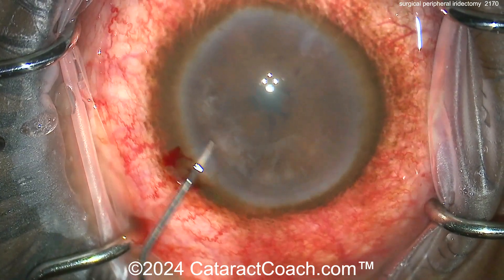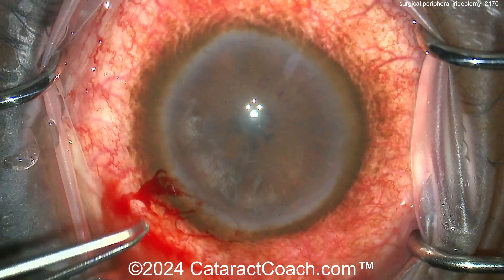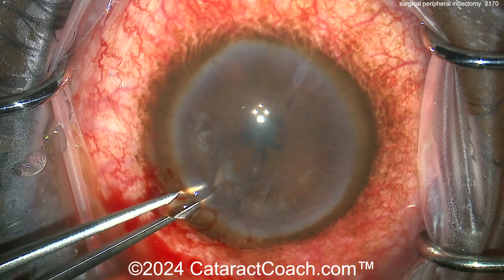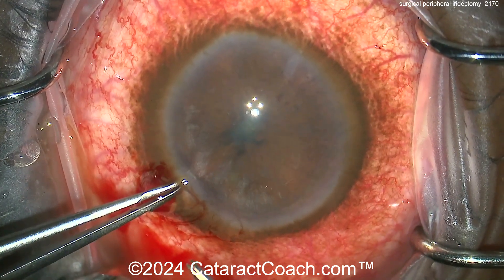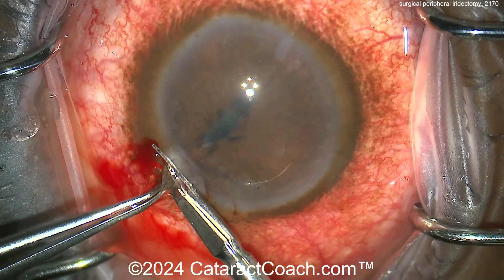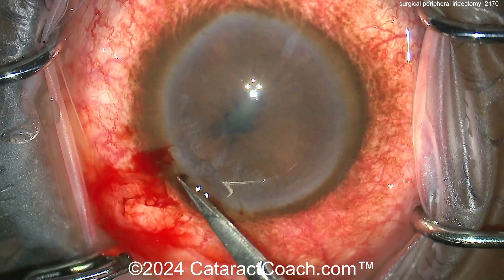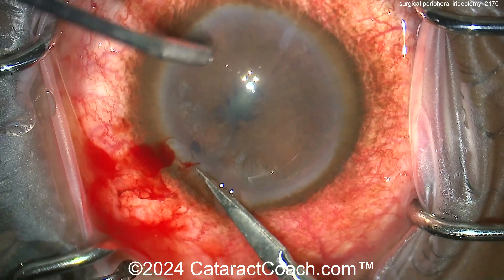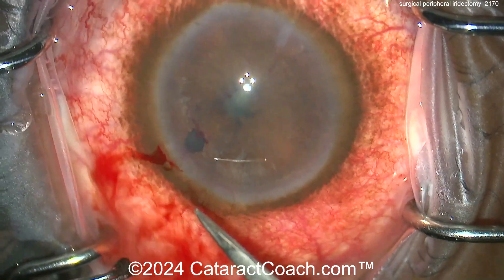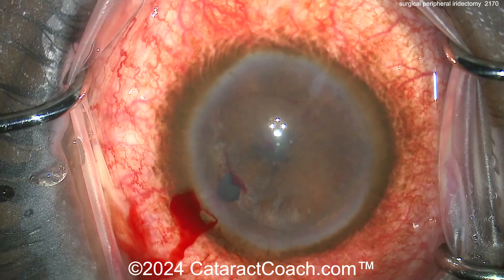Now you can go inside and you want to grab the iris towards the periphery with some forceps and pull it out of the eye. Here using forceps — probably two forceps — pull it out of the eye just a tiny bit. Then using Vannas scissors making a little cut — that's a pretty big cut — and now you've completed your peripheral iridectomy. You can see it goes back in the eye and it looks like a small hole.